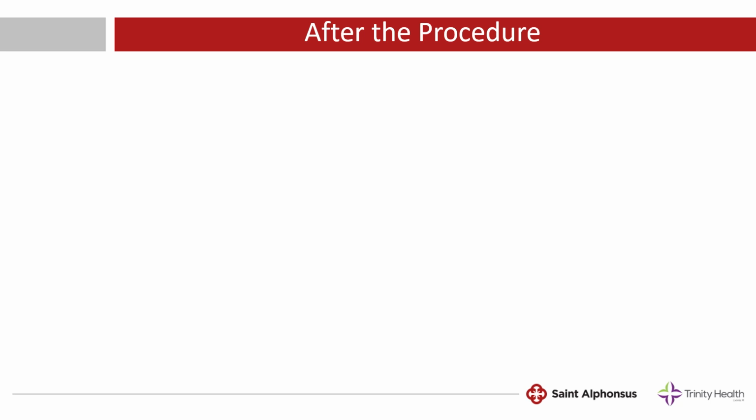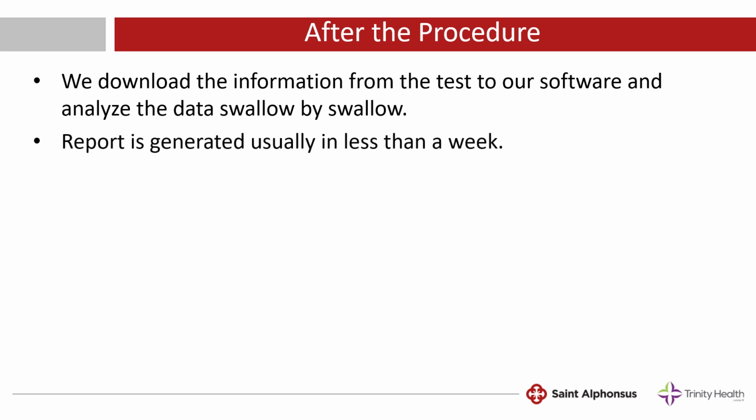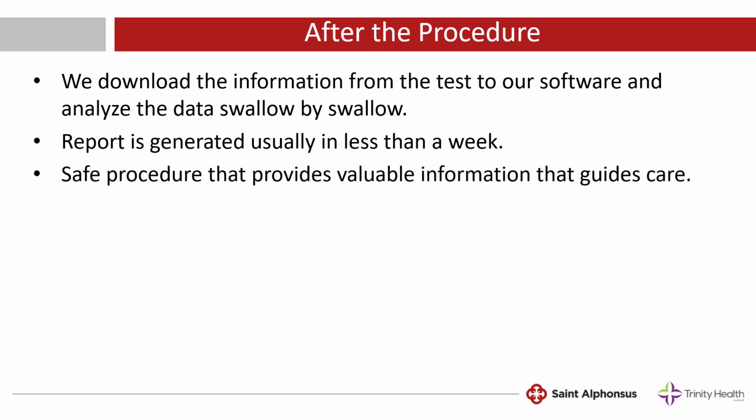After the procedure, we will download the information from the test to our software and analyze the data swallow by swallow. Next, a report will be generated, usually in less than a week. And as a reminder, this is a safe procedure that provides valuable information for your surgeon that can guide care decisions.